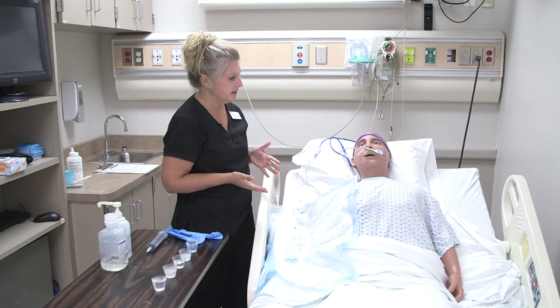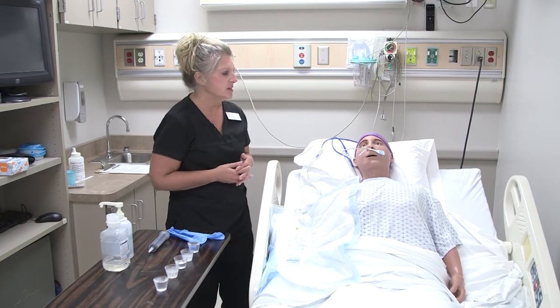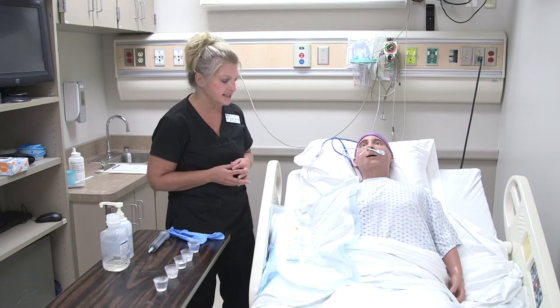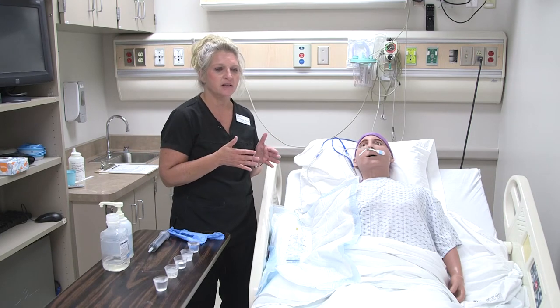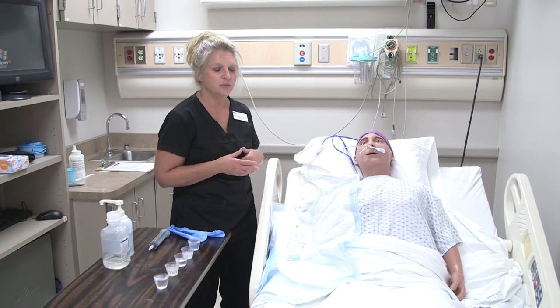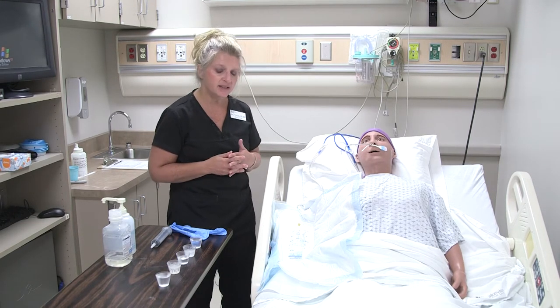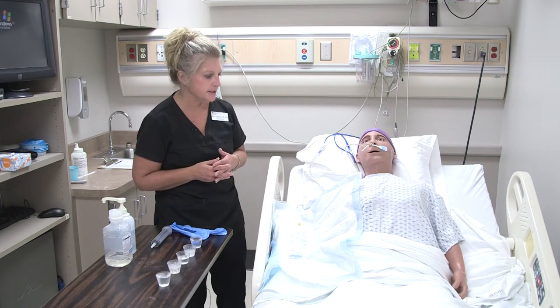We have our patient with the NG tube in and we verified placement. We did that by either measuring the external length of the tube as it exits the nares — that should correlate with what is in the chart from when the NG tube was placed and x-ray verified it was in the stomach. We could also check the pH of the stomach acid. Whatever your facility has as a policy.